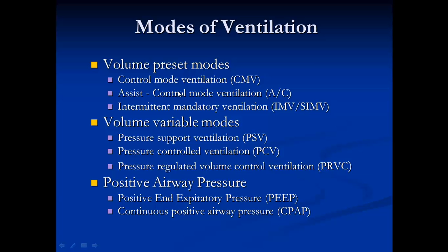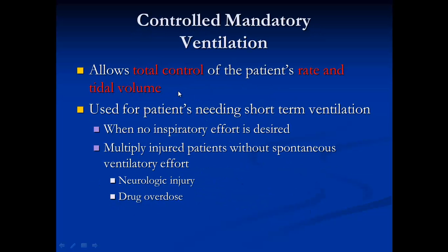So now we'll review the different modes of ventilation. Control mandatory ventilation basically allows total control of the patient's rate and tidal volume. It is used for patients needing short-term ventilation when no inspiratory effort is desired. For example, patients that have multiple injuries, neurological injury, drug overdose.